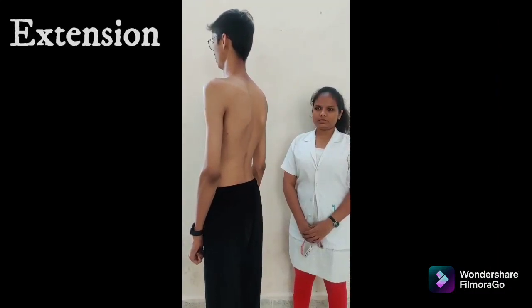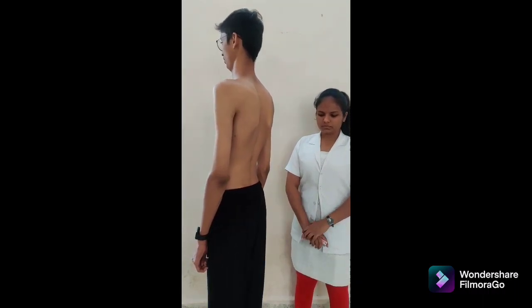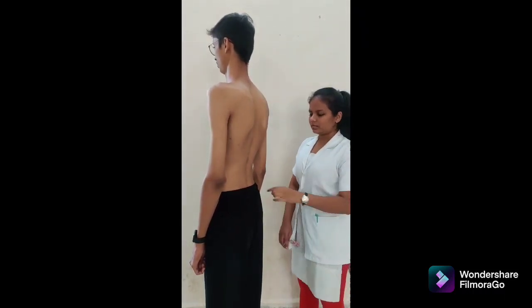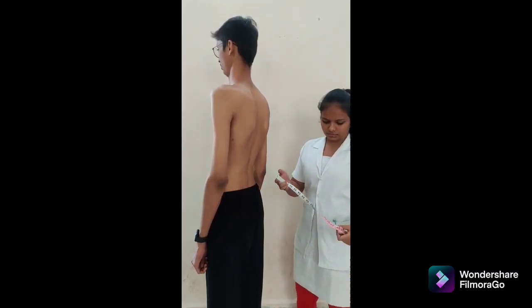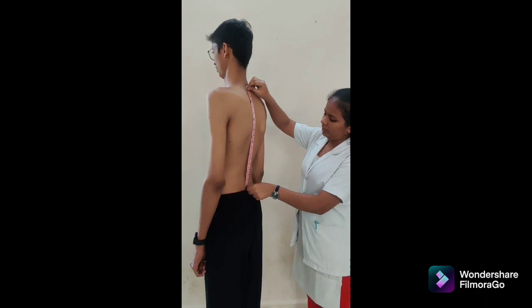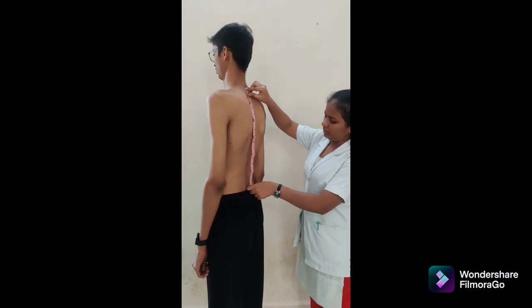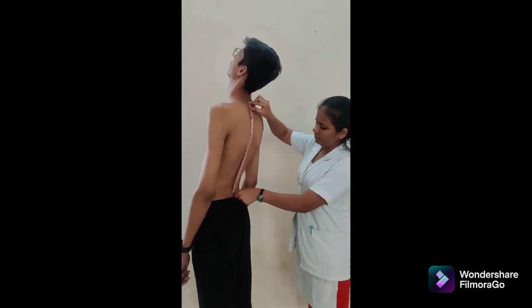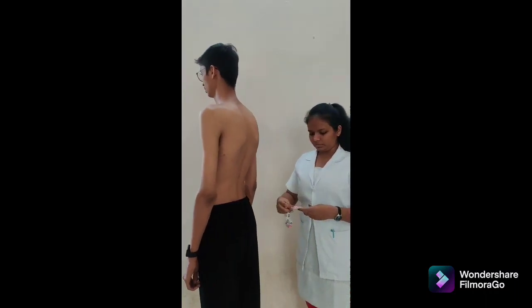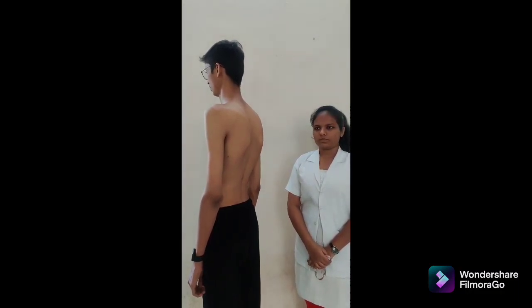There are three methods to measure thoracolumbar extension. First is tape measurement. Patient position: standing with feet together and knees straight. Tape alignment: place one mark over the spinous process of T1 and another at S2. Measure and record the distance at the start of range of motion. The therapist should ensure no posterior pelvic tilt occurs. Instruction: bend backward as far as possible while keeping arms relaxed and knees straight. Hold the tape in place. Record the distance at end of motion and measure the difference.